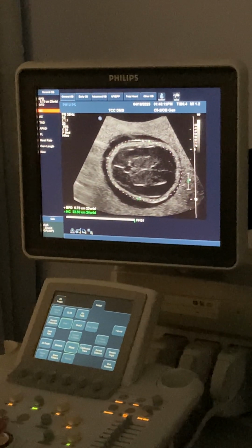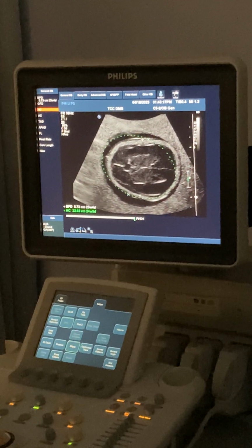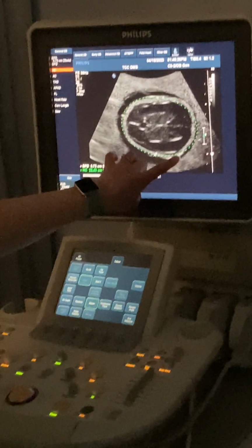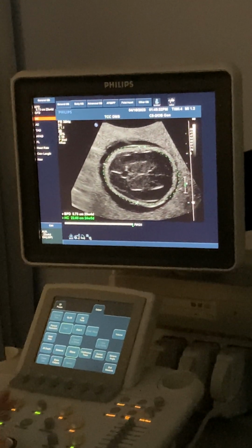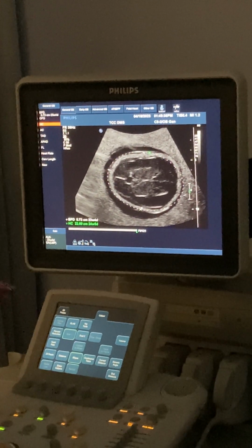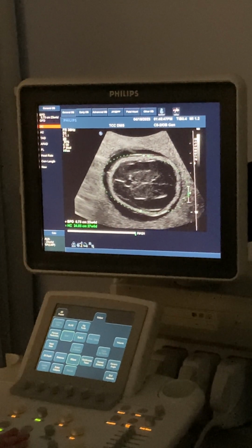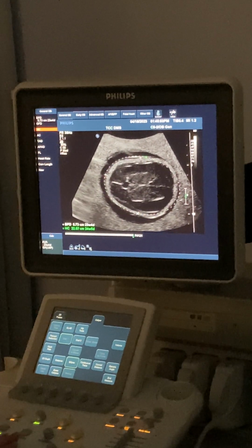What I don't want for under and overcompensation is something like this. Well, I'm overcompensating here and undercompensating here. It's like, no, no, no. If I'm gonna undercompensate and overcompensate, it's just going to be ever so slightly, a little bit off here and a little bit missed here, because no skull is gonna be perfectly shaped like that, right? So a little bit of over and undercompensation is okay. We don't want it to be like I said, overcompensation, undercompensation, something like that. We want to still at least try to be around the skull as best as we can, and might have a little overcompensation.